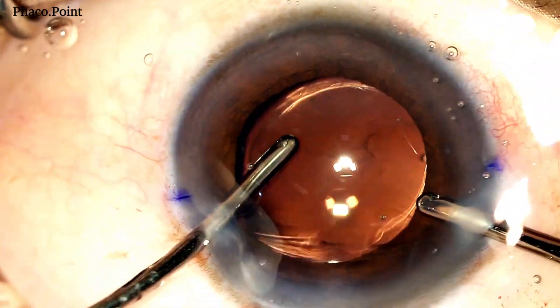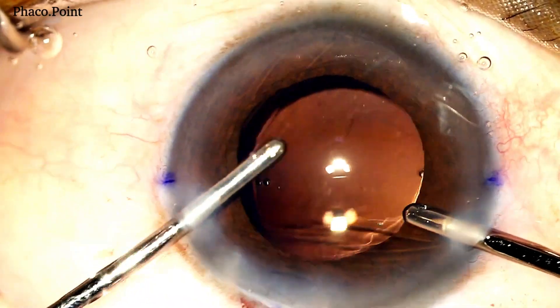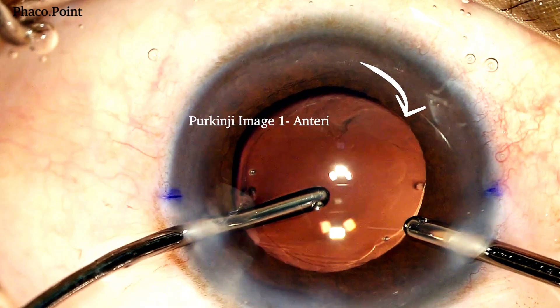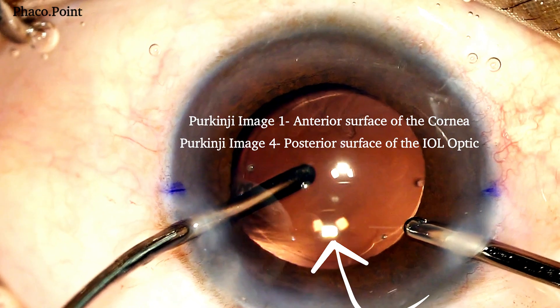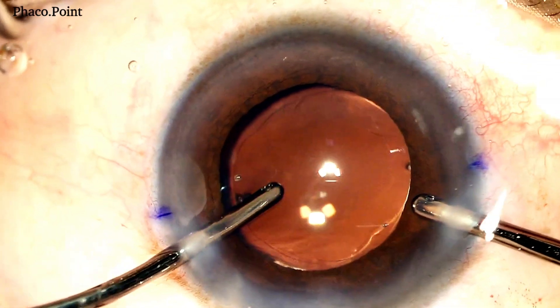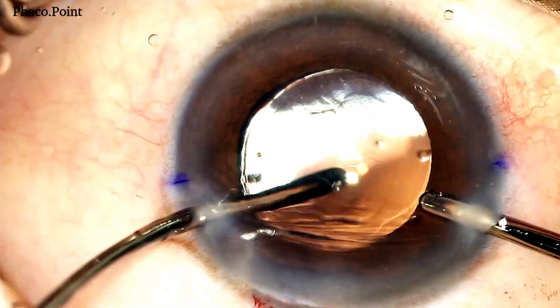Let's see how we confirm that the alignment is optimal. In order to ascertain the optimal placement of the IOL, we take the two Purkinje images — image 1 on the cornea and image 4 on the posterior surface of the optic. Under direct visualization, we need to superimpose both these images one on top of the other. This signifies that the eye is perfectly aligned in the visual axis.